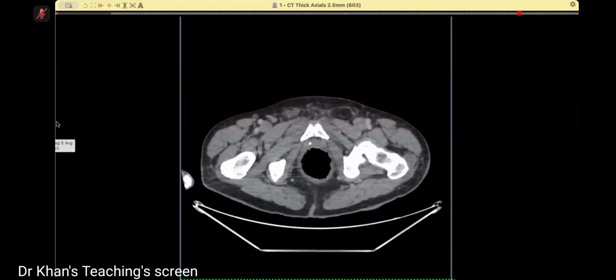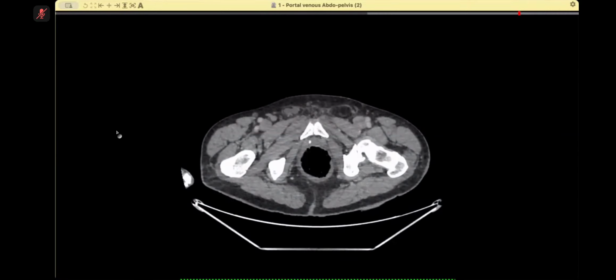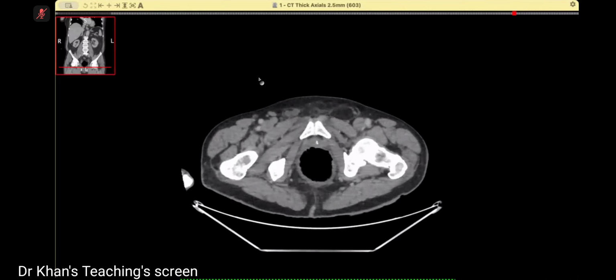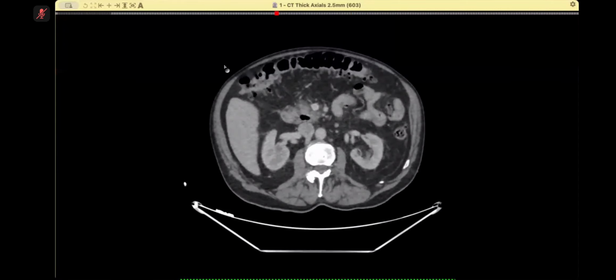Now you have got A&E. Just 1 second, this one. Acute abdomen, A&E, 71-year-old. Over to you. Mouse, yes.